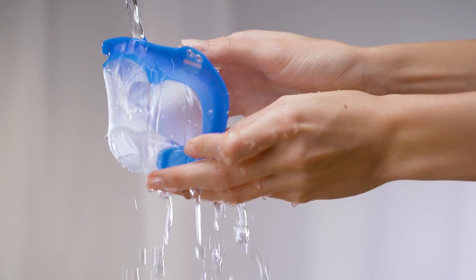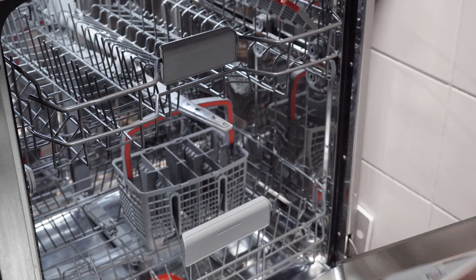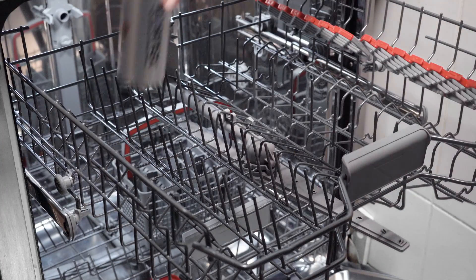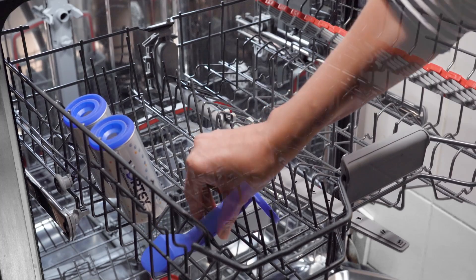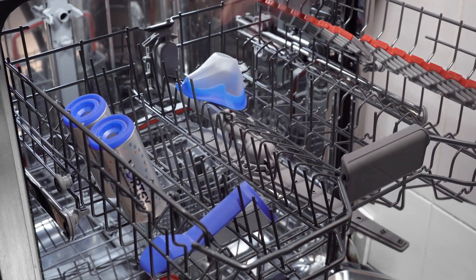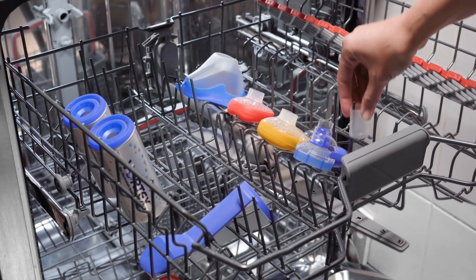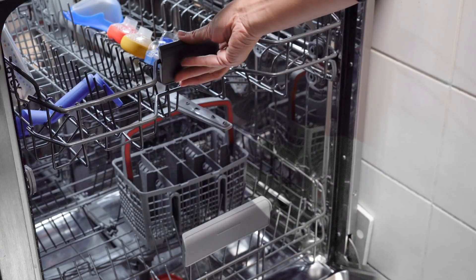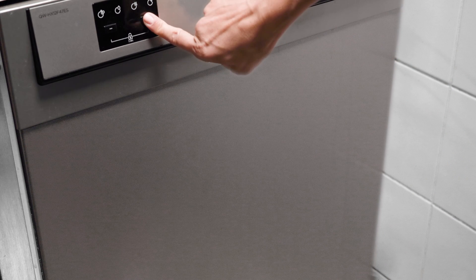Rinse all parts thoroughly under running tap water. Alternatively, place the parts in a dishwasher connected to a main water supply. It's important that you do not clean the Vortex together with very dirty dishes. Position all parts so that no water can collect in them, and select a program with at least 50 degrees Celsius.